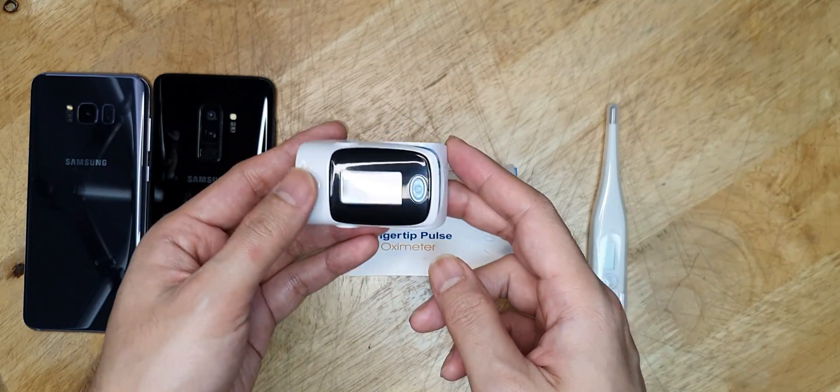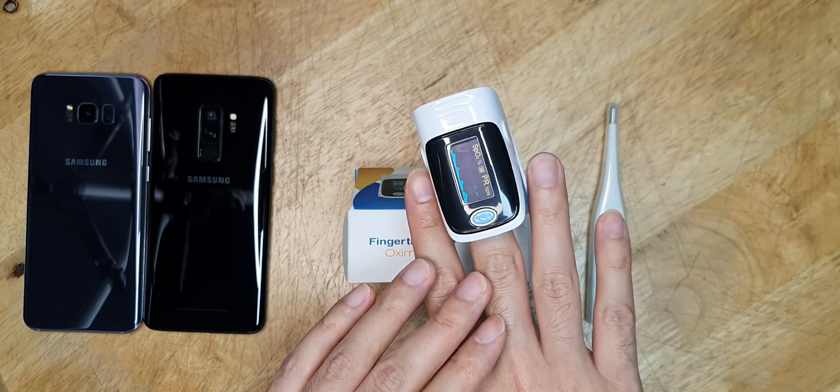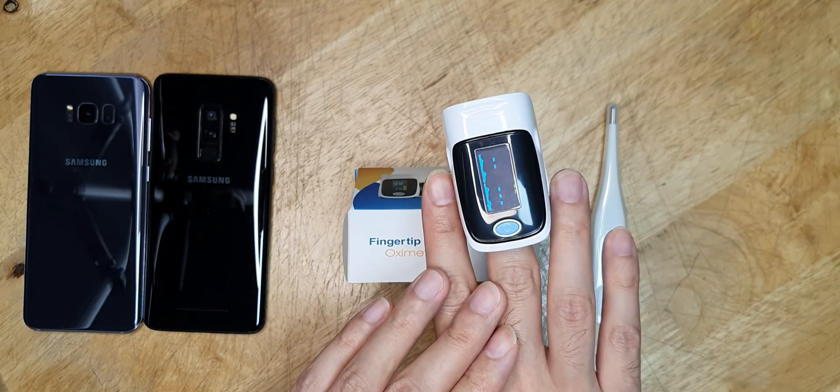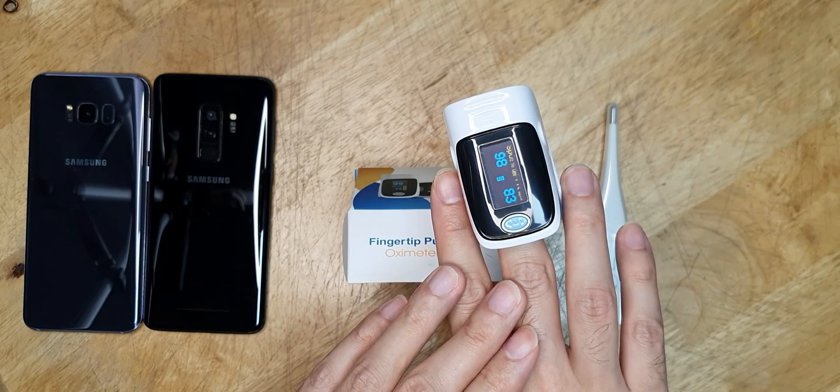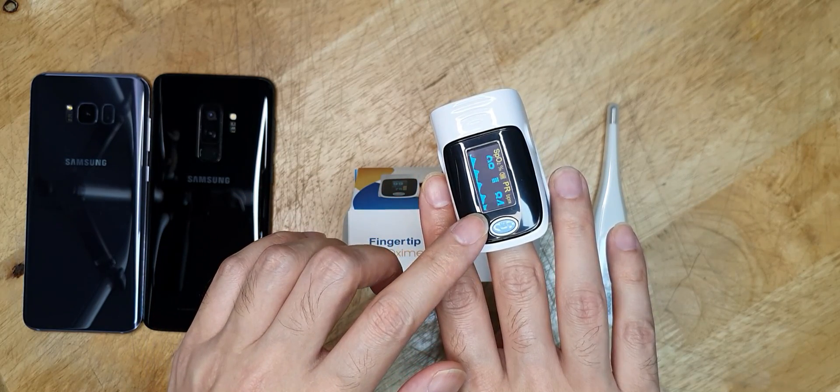It's a very simple device. Put it on one of your fingers and it will measure the oxygen level in your blood, displaying the oxygen level — like 98% — and the heart rate, which is 84.